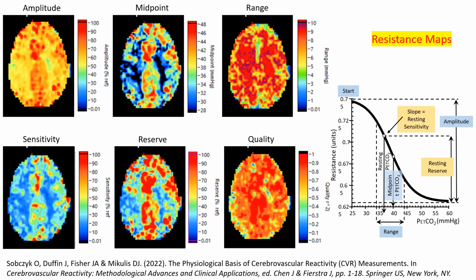The resistance model approach accounts for the four types of BOLD responses to a ramp of carbon dioxide challenge, resulting from redistribution of flow between vascular beds, and it calculates the pattern of the intrinsic sigmoidal flow resistance changes. It therefore provides an estimate of a physiological parameter, resistance, relative to a universal ideal reference standard, and thus leads to physiological explanations for the observed BOLD response patterns that we have just reviewed.